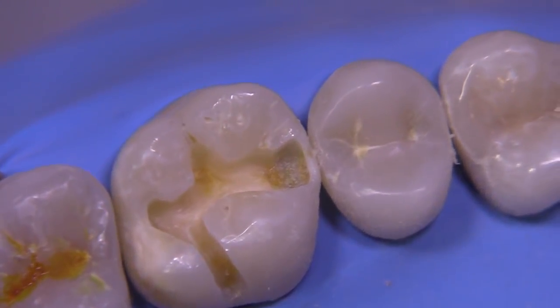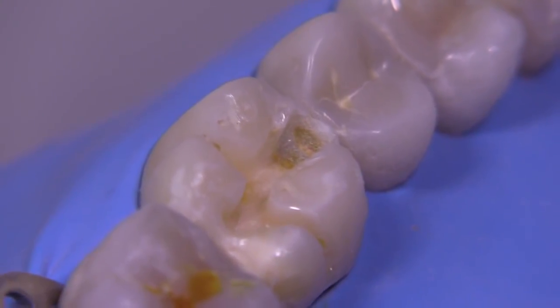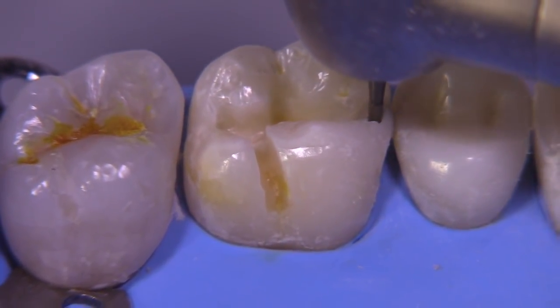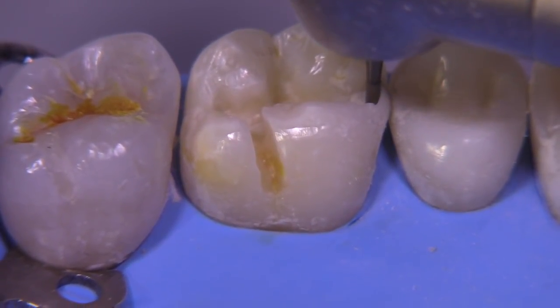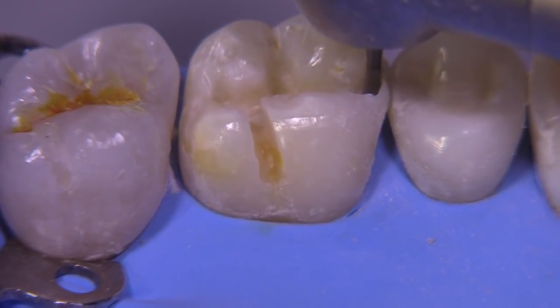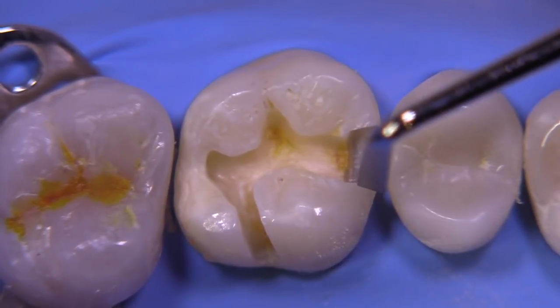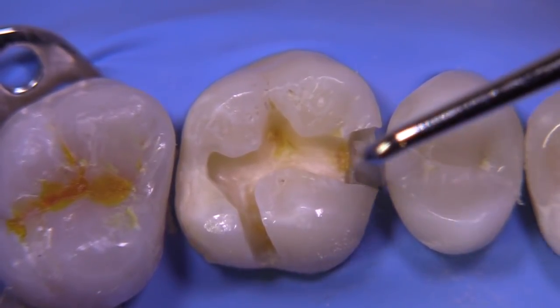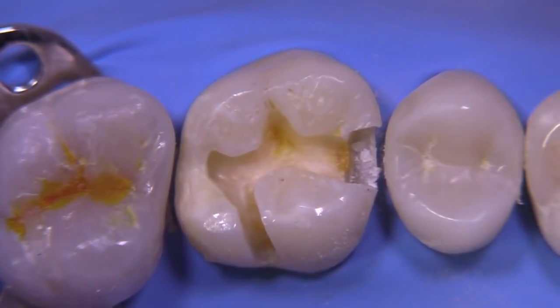Now we're dropping our box using a 245 bur. You can see how thin that enamel shell is — plus it's caries all the way through to that composite. We're going to keep the burr away from the adjacent composite so that we don't damage it, and just move the burr buccolingually and move it down gingerly until the little piece breaks off. We can refine the box a little bit. Even though this is not an amalgam, it's nice to use some hand instruments — here I'm using an off-angle chisel just to remove loose enamel rods and even create a little bit of a flare.